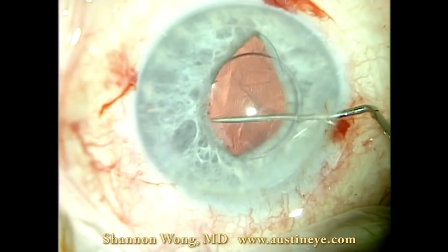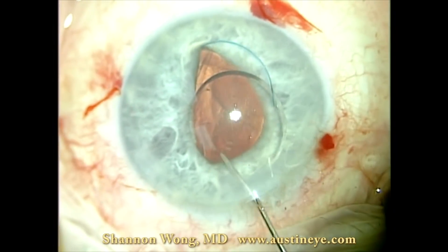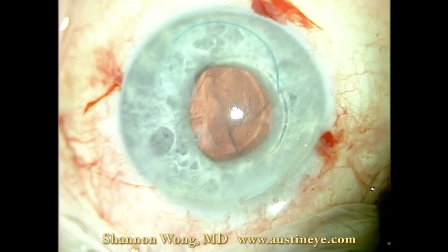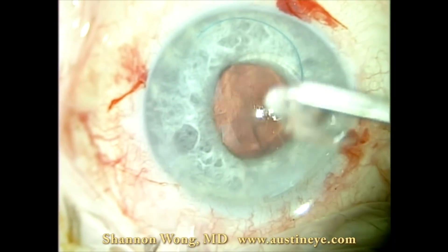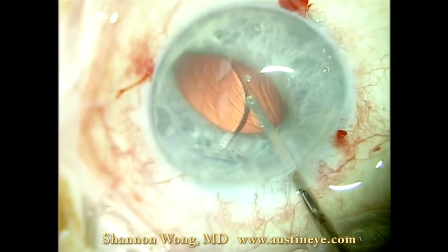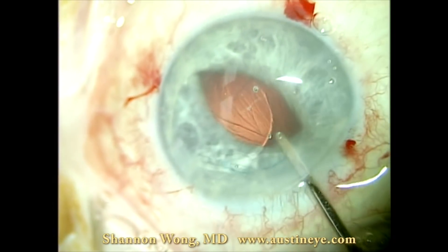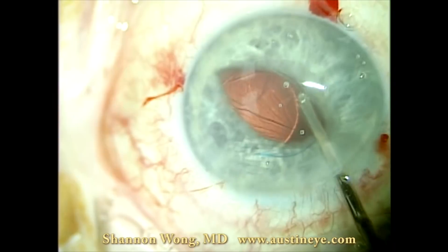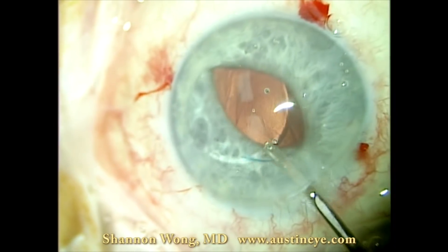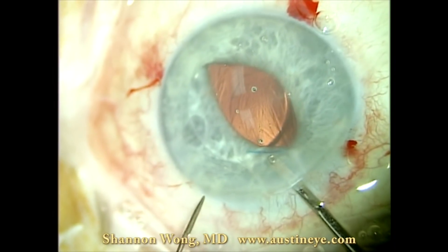I'm going to demonstrate a case where we did an iris suture fixation of a three-piece Tecnis multifocal lens implant, and the patient did quite well. The original situation was that during his primary cataract surgery the patient had an open capsule, which we elected to address by placing the three-piece Tecnis multifocal in the sulcus. But on post-op day one, the lens appeared to be subluxed, so we elected to take the patient back to the operating room and suture fixate this lens to the iris.